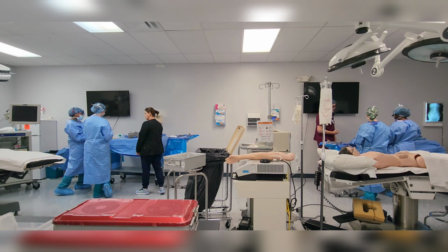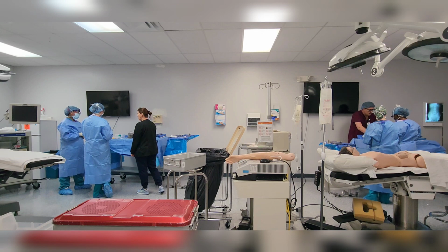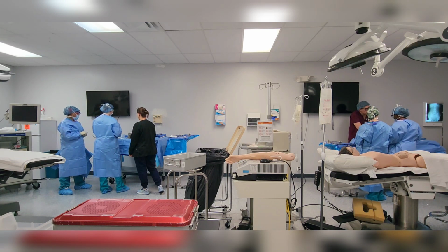So here's what I would do. Your Russians, your DeBakey's, smooth ones, smooth tissue forceps, your atraumatic. This is perfect for it.